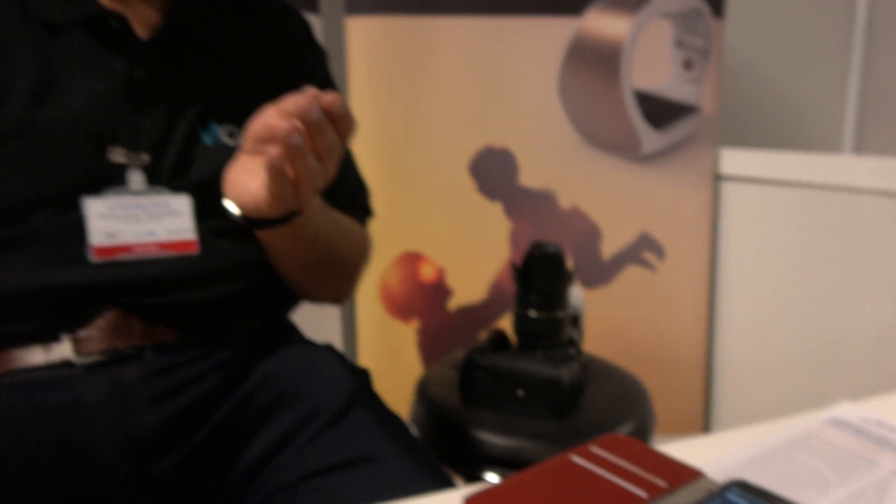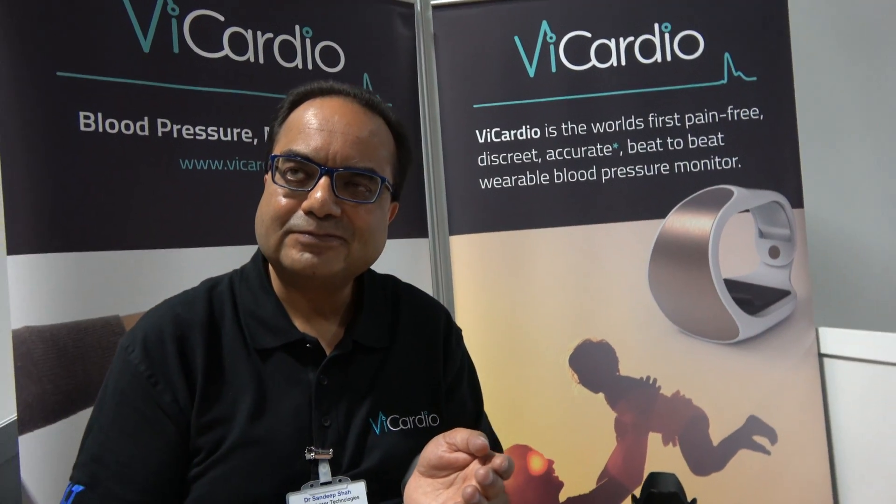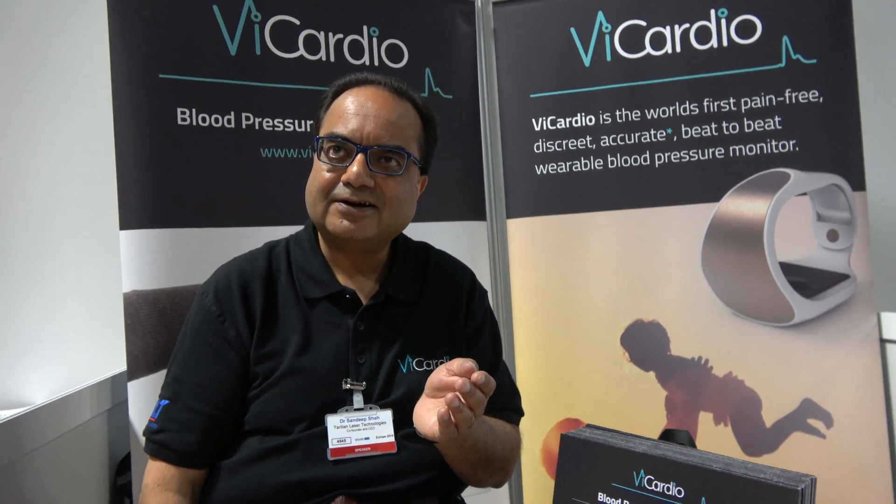How is it different from any other solution that takes blood pressure right now? The standard arm cuff is based on a cuff that constricts the artery, stops the flow, and then measures the vibration in the cuff to try and estimate what your blood pressure is — it doesn't actually measure it directly. That's called oscillometry — very poor functioning technology that we've been living with for over 40 to 50 years. This is novel, fresh, very dynamic, giving very accurate readings in a form factor suitable for the modern-day digital consumer.